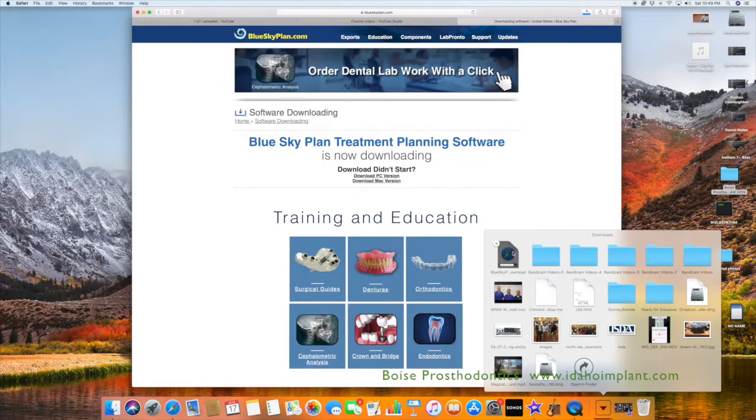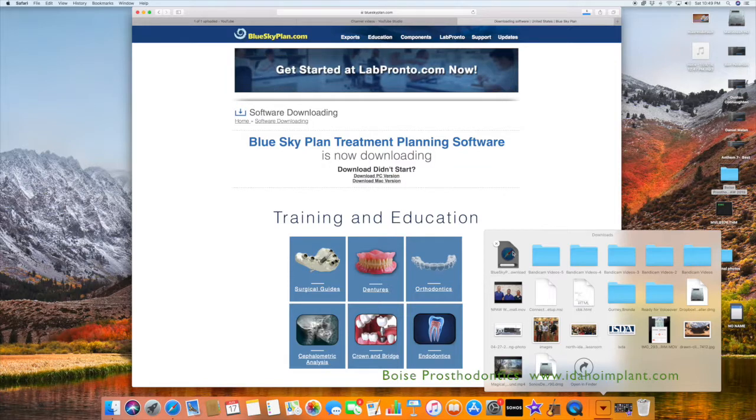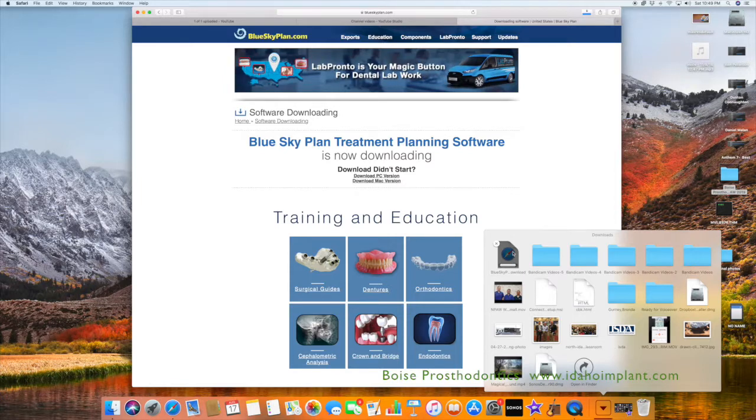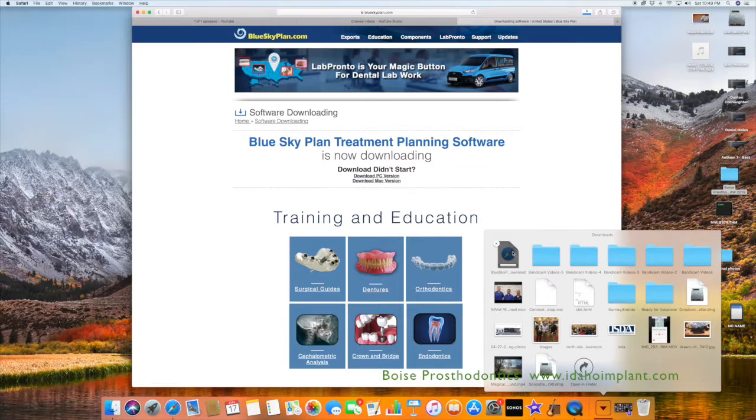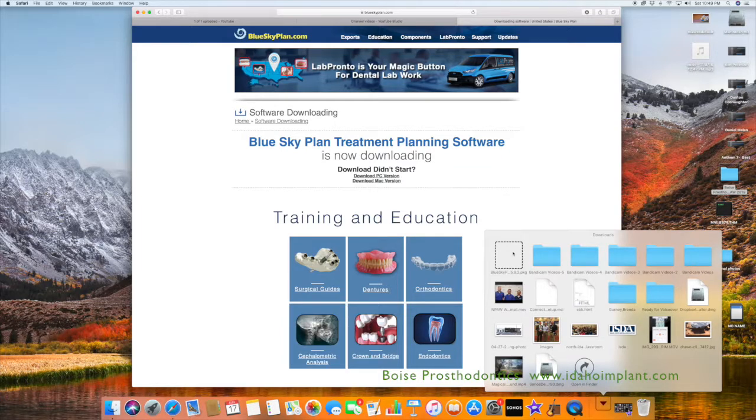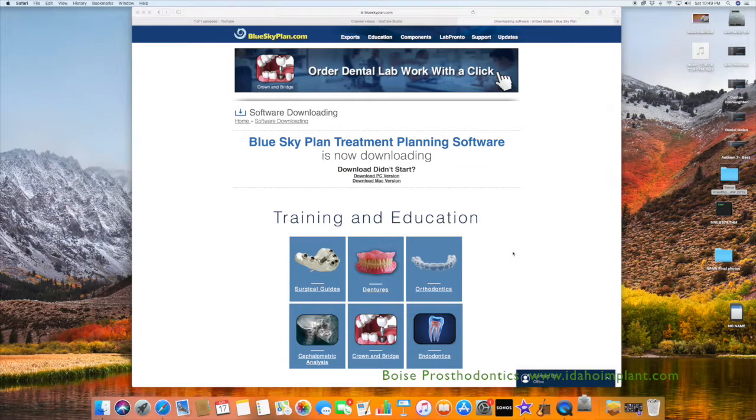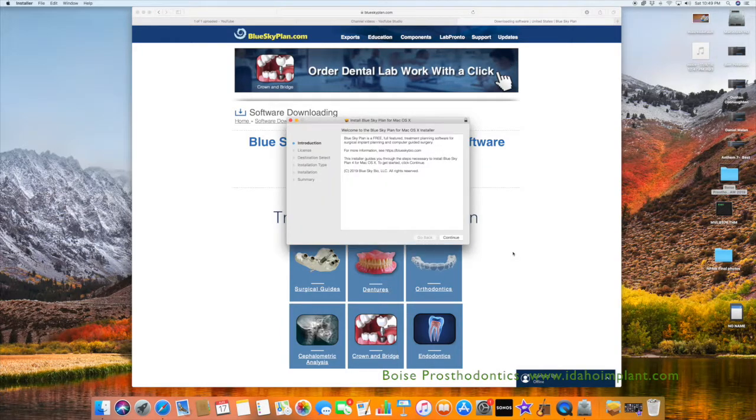Now the download is almost complete and you'll see the little icon of like a box that's opened with something inside up here. When it has appeared, you just double click on the box and it will walk you through the process of installation.